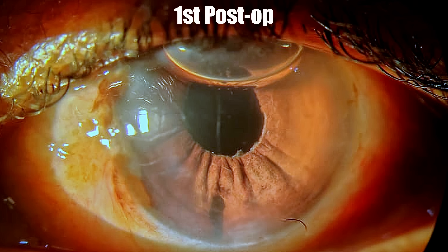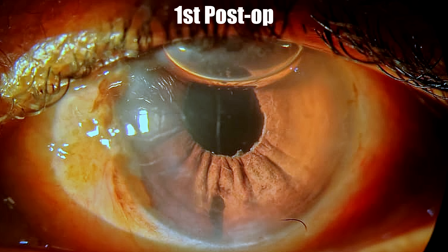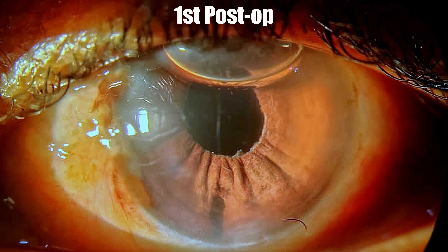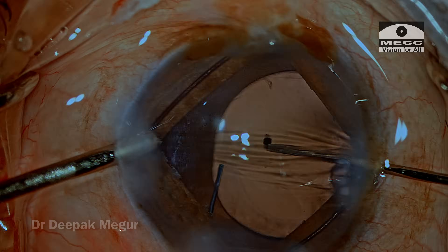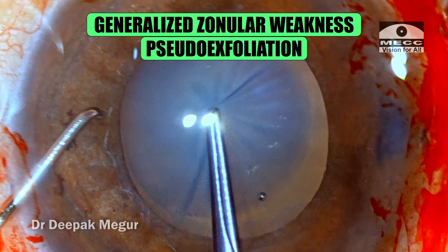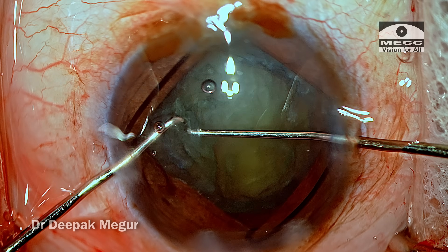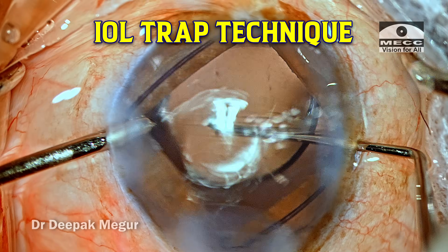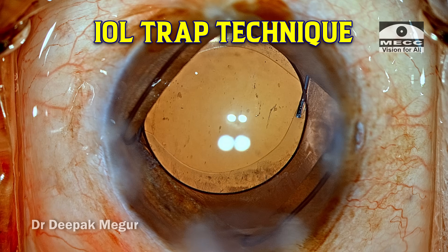The case is done. These are the first day post-op pictures. The patient is doing reasonably well. The lens is quite well centered and there is very minimal pseudophacodonesis. The pressures are under control. The patient is on medications and would be advised lifelong follow-up for monitoring intraocular pressure. To summarize: the IOL trap technique is an excellent way to deal with eyes with generalized zonulopathy, especially with pseudo-exfoliation. They definitely fare well compared to placing both the lens and the CTR inside the bag. For very loose bags, fixating the bag to the sclera would be a better option, but otherwise this is a reasonably efficient technique for managing moderate zonulopathy.